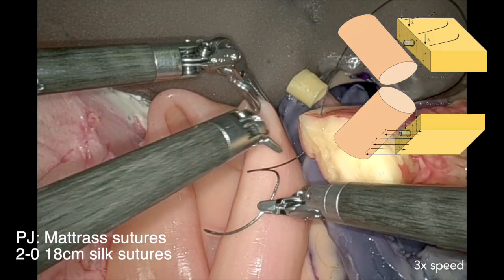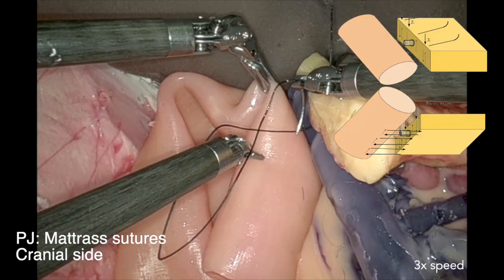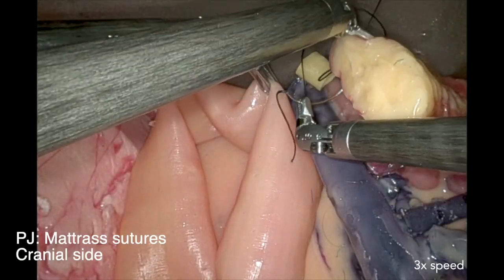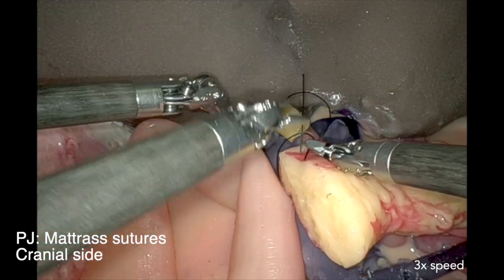This Blumgart anastomosis starts with three mattress sutures. These mattress sutures follow the same steps: first transpancreatic, then through the bowel, then transpancreatic again in the other direction.